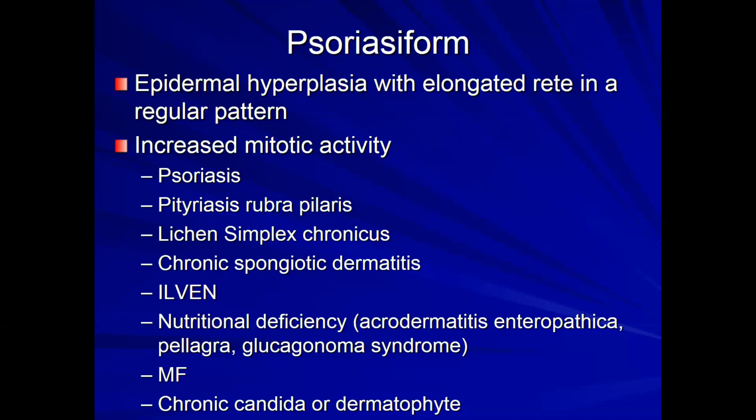So this tissue reaction is referring to the changes in the epidermis that result from or are part of this inflammatory process. Dermatitis refers to inflammation in the dermis. Panniculitis refers to inflammation in the fat. And so given these tissue reaction patterns, meaning the changes in the epidermis, with the addition of the pattern of inflammation in the dermis or dermis and subcutis, then we have different differentials.